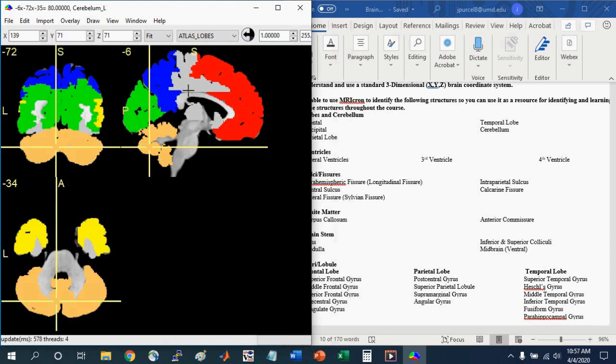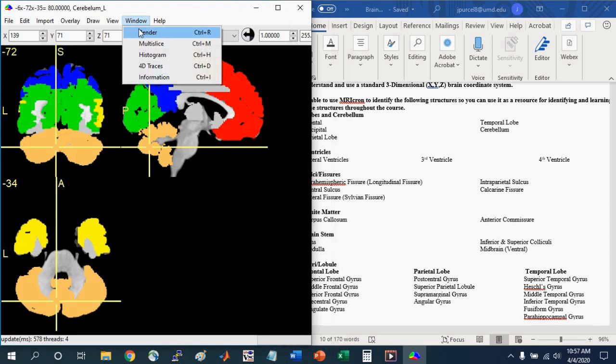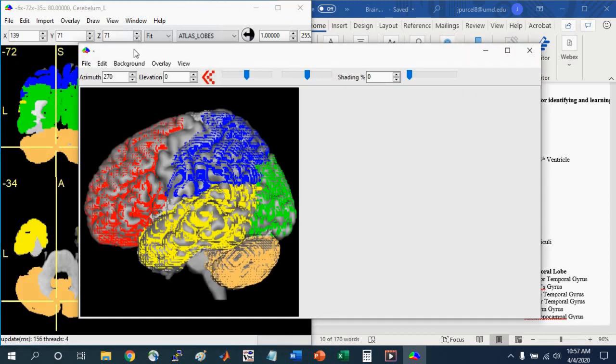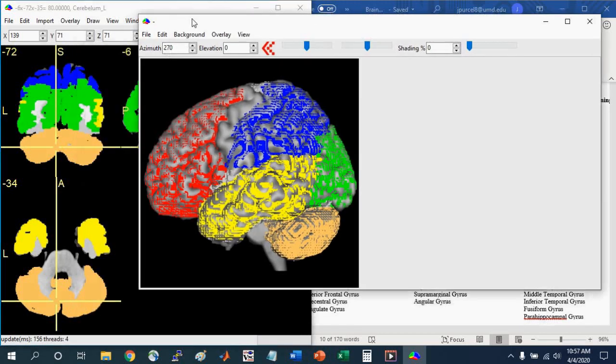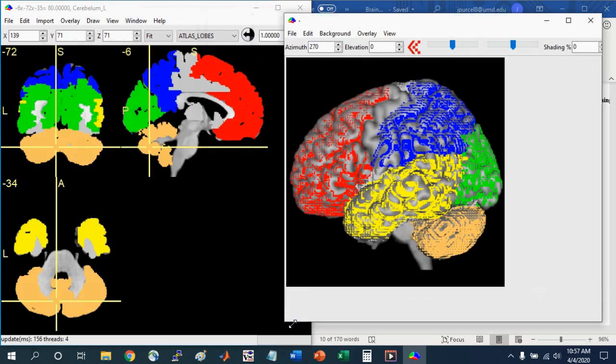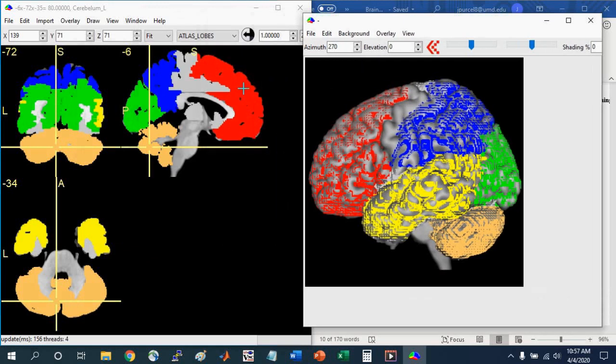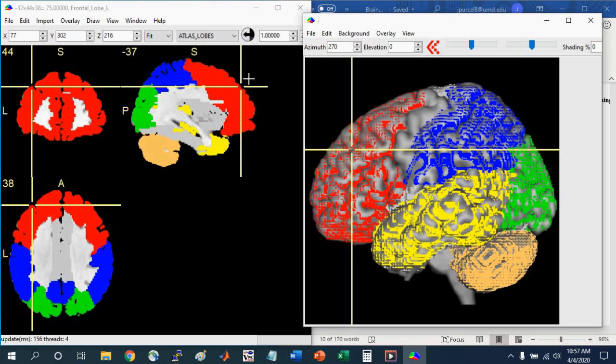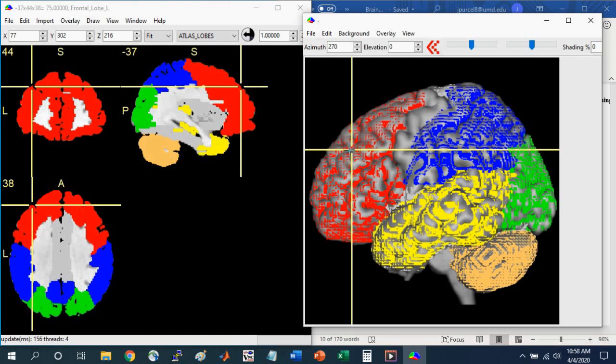Just by clicking around and navigating through the brain in this manner, you can learn how these different structures relate to each other. To help you do that, you can also use a 3D rendering tool. So you can go to Window, Render. Here you see a 3D projection of this brain with the colors on top of it. You can see this red area here. If I left click on the rendered view, it jumps to the surface in the slice view. You can see in the sagittal, coronal, and axial views where on the surface of the brain it is.